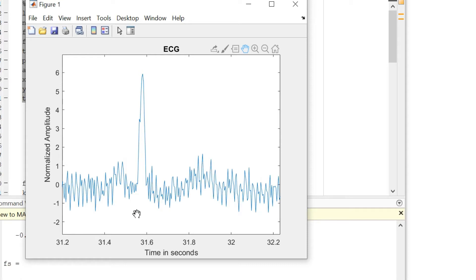This looks a little jagged because these points are not synchronized or averaged with multiple samples. These are just one reading. We usually get much smoother curves once we have taken multiple samples and then averaged the value of those samples.